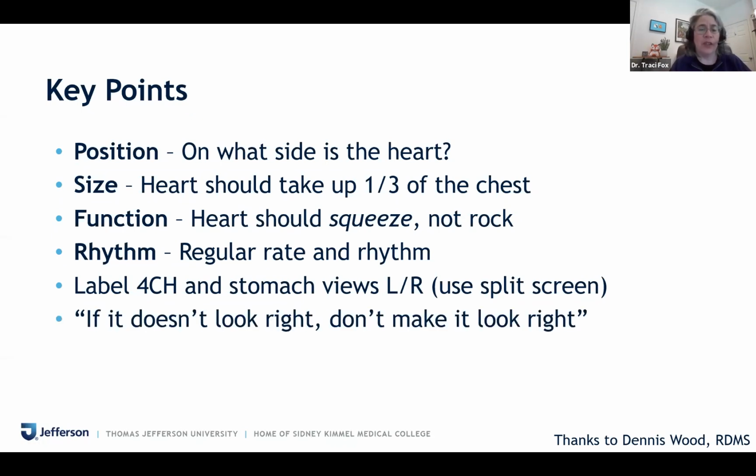because of course the fetus can be in any position. I have 2 Dennis Woodisms that I'll mention, but he told these to me over 20 years ago, and I've been using them ever since. If it doesn't look right, don't make it look right. And I can't tell you how many times I've used this principle.